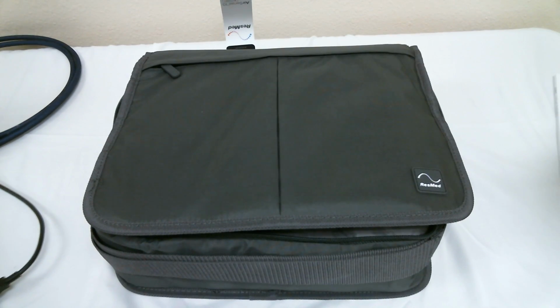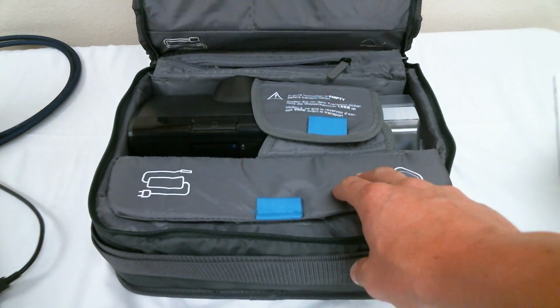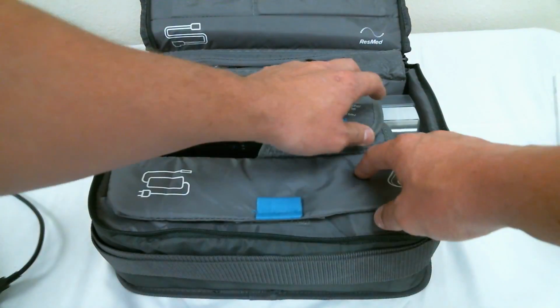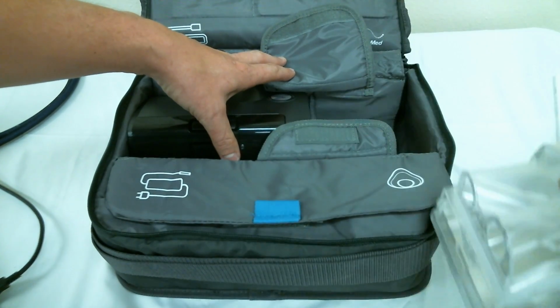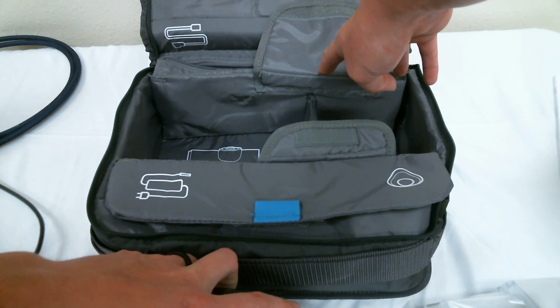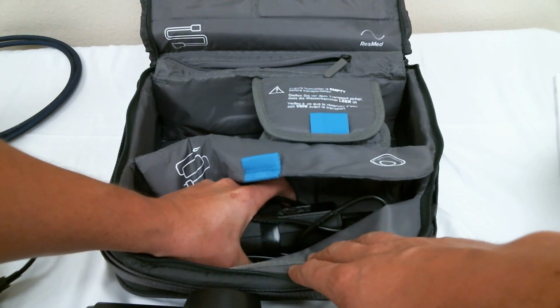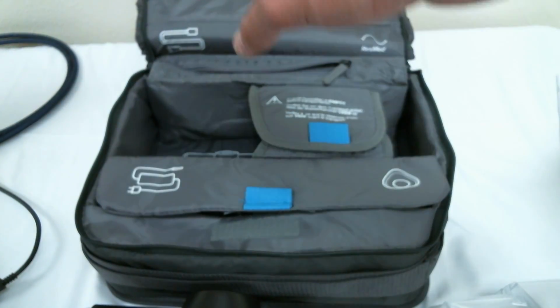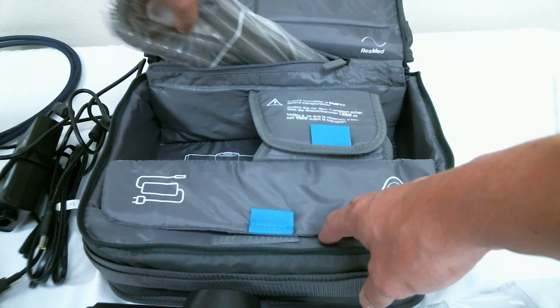Today I'm going to demonstrate to you how to unpack, set up, and operate your ResMed Airsense device. Let's start by unpacking the device and accessories. First, let's remove the machine and the humidifier chamber. We'll set them to the side. Next, let's take out the power cords from the front and your tubing from the back.